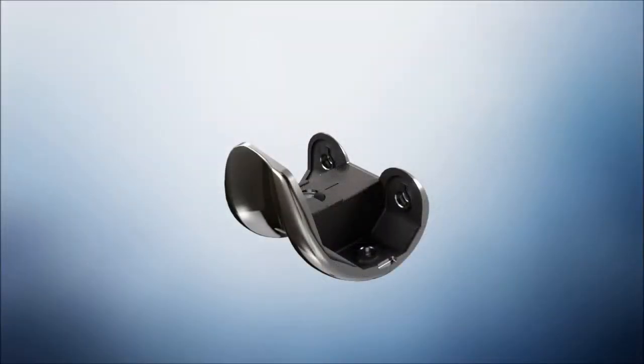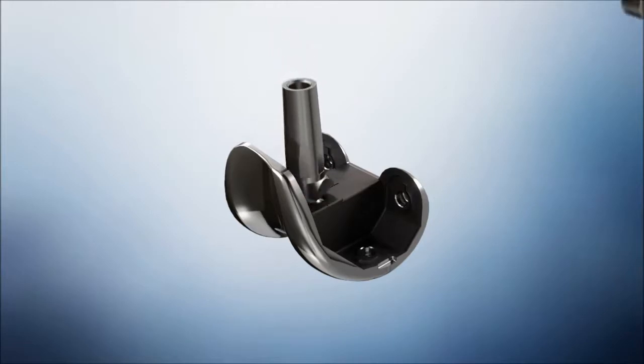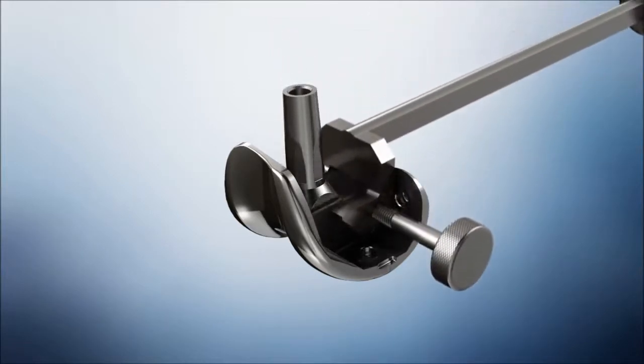For assembly of the Sigma knee femoral components with the femoral adapter, select the correct femoral component size and the correct femoral adapter and bolt that correspond to the position selected with the revision 4-in-1 cutting block. Pass the bolt through the hole of the femoral component and assemble into the Sigma knee femoral adapter positioned on the top of the box.